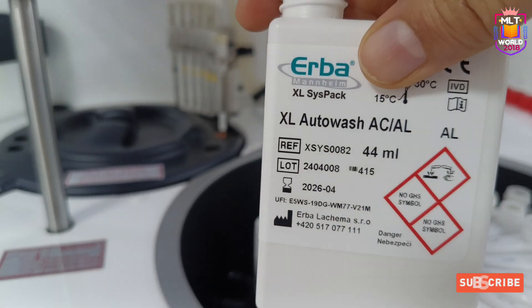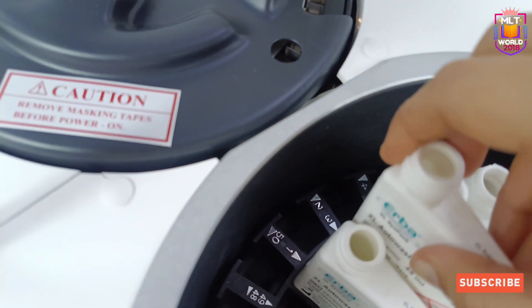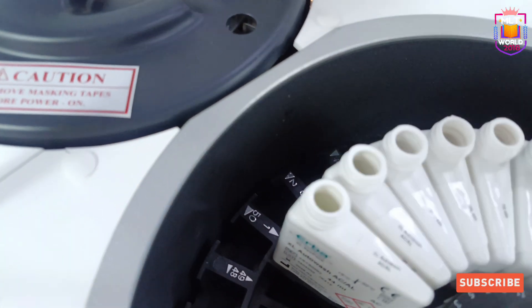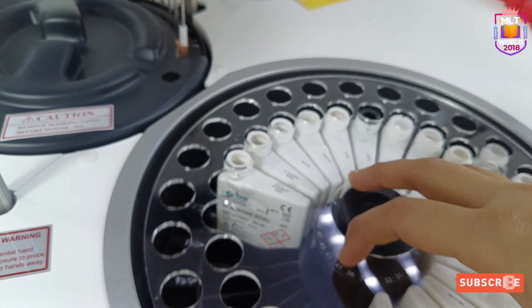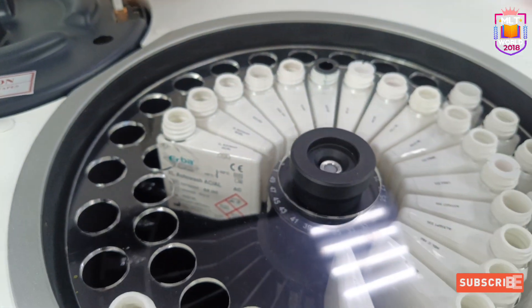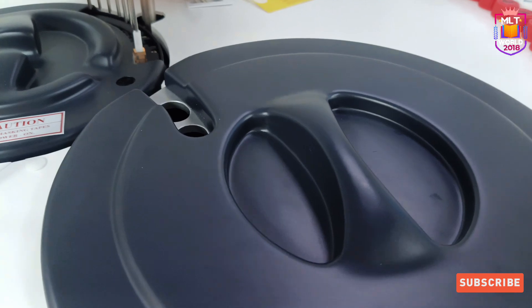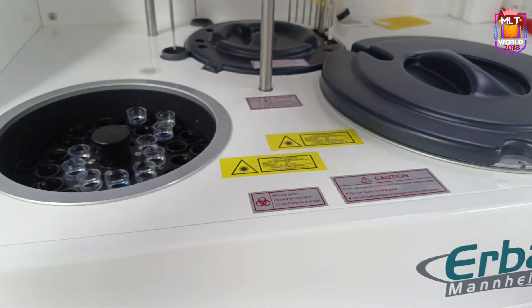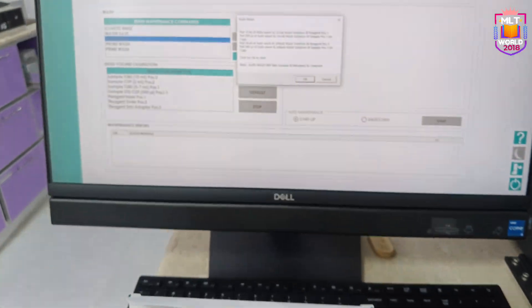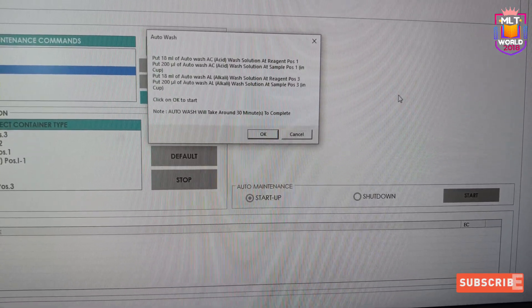This is the AL solution and we will keep it at position 3. Now we will place the plastic tray back and close the cover of the machine. Everything is assigned, so we close the cover and click start. It will take around 30 minutes to complete.